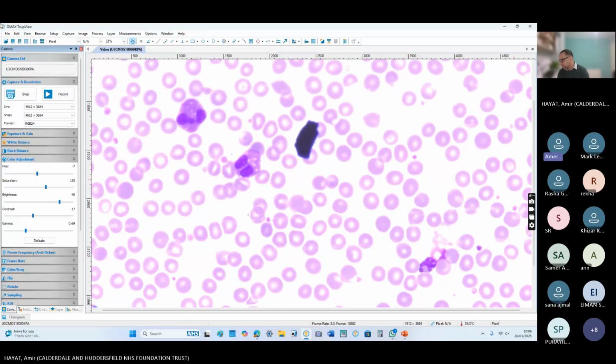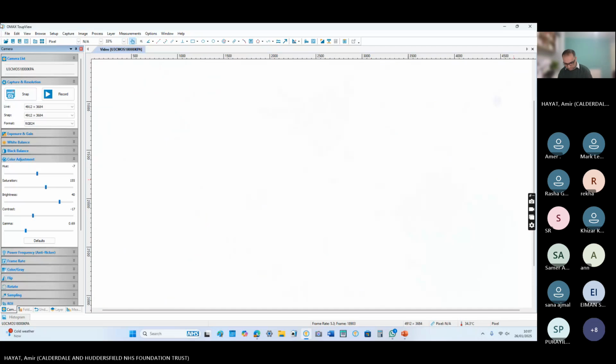Okay. In the bracket, you can write for PDGFRA, PDGFRB, and FGFR1 or FIP1L1, flow cytometry, and serum tryptase. If there is any clonal cause, you will get it on these tests: FISH on the peripheral blood, and the immunophenotyping and tryptase. Why are we doing tryptase for this patient? For systemic mastocytosis. The eosinophilia panel consists of FISH, immunophenotyping, and serum tryptase.